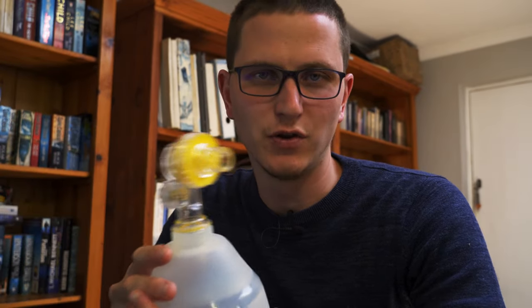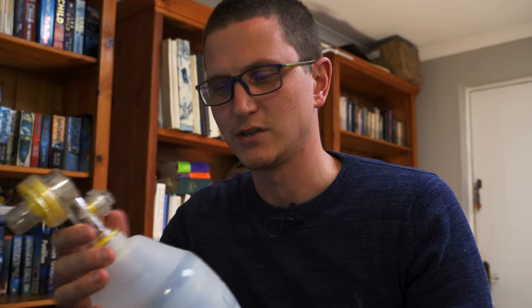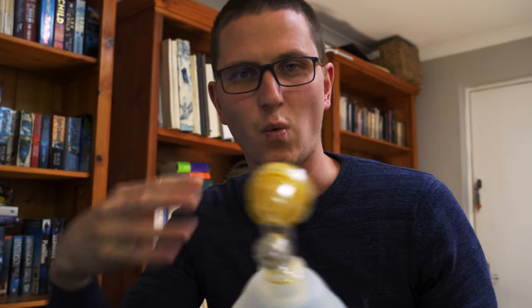There's also the pop-up valve to consider. When using a BVM and mask with head tilt chin lift, air either goes into the trachea or into the stomach. The pop-up valve on this one pops off at 40 centimeters of water. In a typical ventilation — say, setting up a ventilator — the maximum pressure you want in the lungs is about 25 to 30 centimeters of water. So if this is popping off, we are already giving way too much pressure.